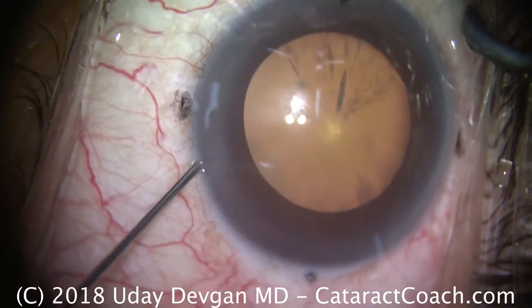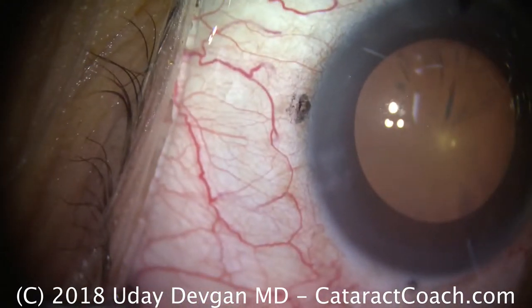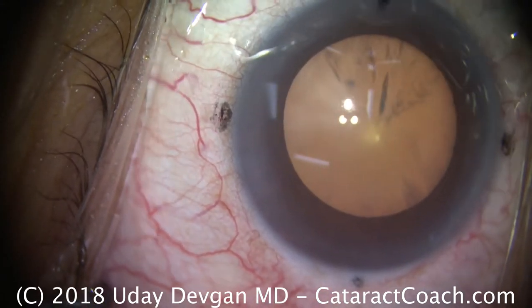Welcome from your cataract coach. Let's look at a routine case here. We're instilling some anesthetic inside this eye. The patient's a little squeamish and has gotten a little bit of intravenous Versed to help relax. Now we're putting some preservative-free lidocaine in the eye and also on the cornea.